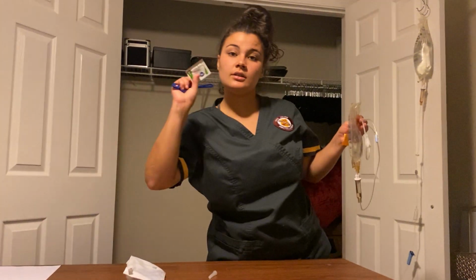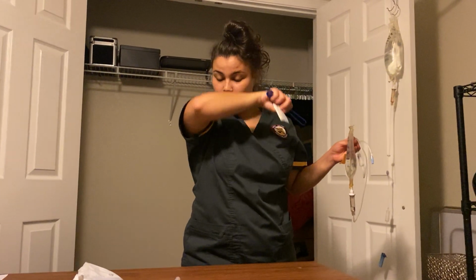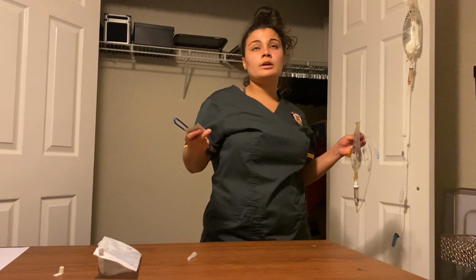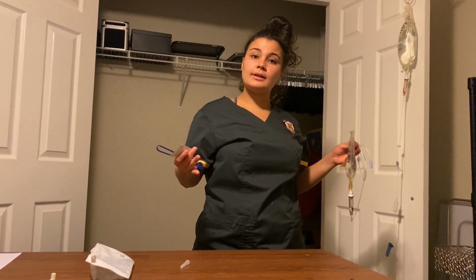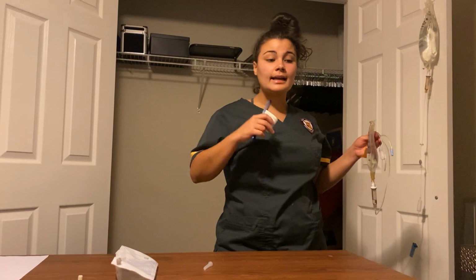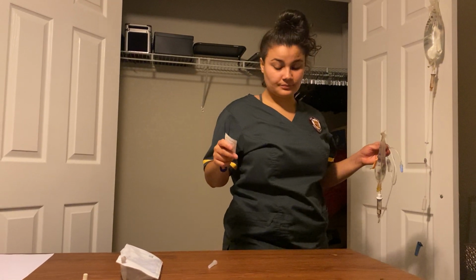and my hanger and my medication swab, my antiseptic swab, to my patient's room. When I go to my patient's room, I'm going to identify them in three ways. I'm going to ask them their name and date of birth, and I'm going to check their wristband. I'm going to introduce myself, explain the procedure, and verify allergies.